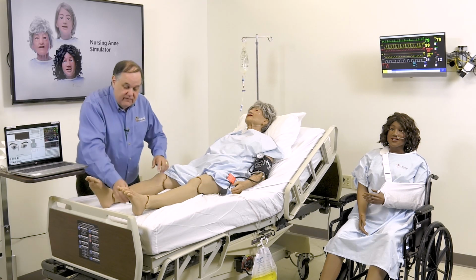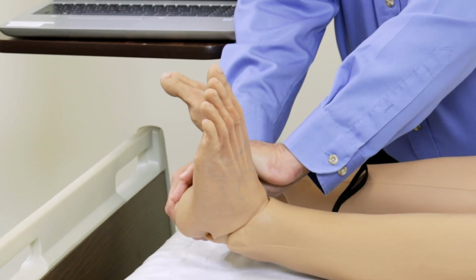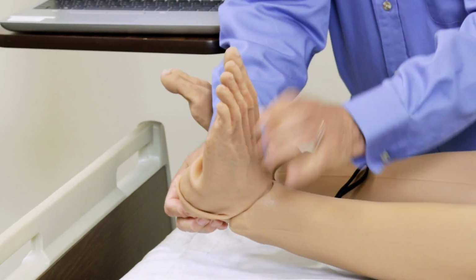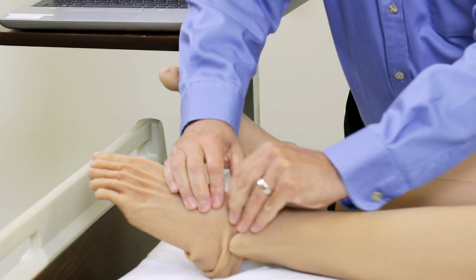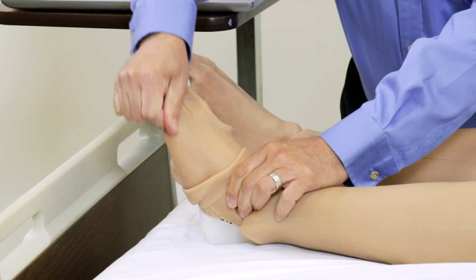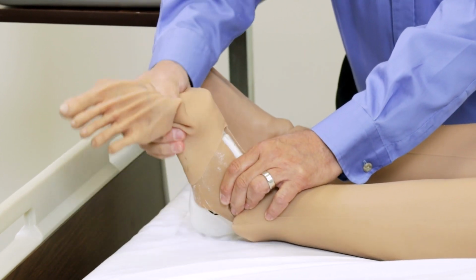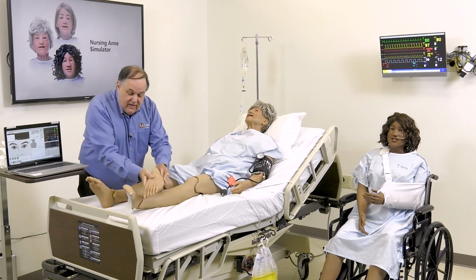So it starts with her feet. We can see how easy the skin comes off her feet. It's not difficult. It's all brand new rubber, so we just have to be patient. It may take about 10 or 20 minutes, depending on how proficient you are. But we simply just take the skin off. We're taking our geriatric skin off, but putting our normal skin on, or taking our normal skin off, would be the same way. So we have a simple skin. So that's her foot. That's how easy it is.